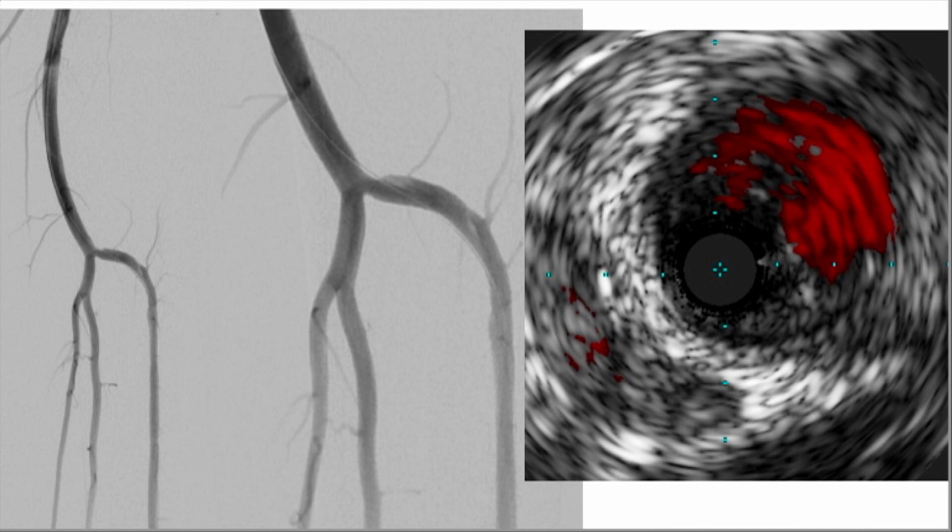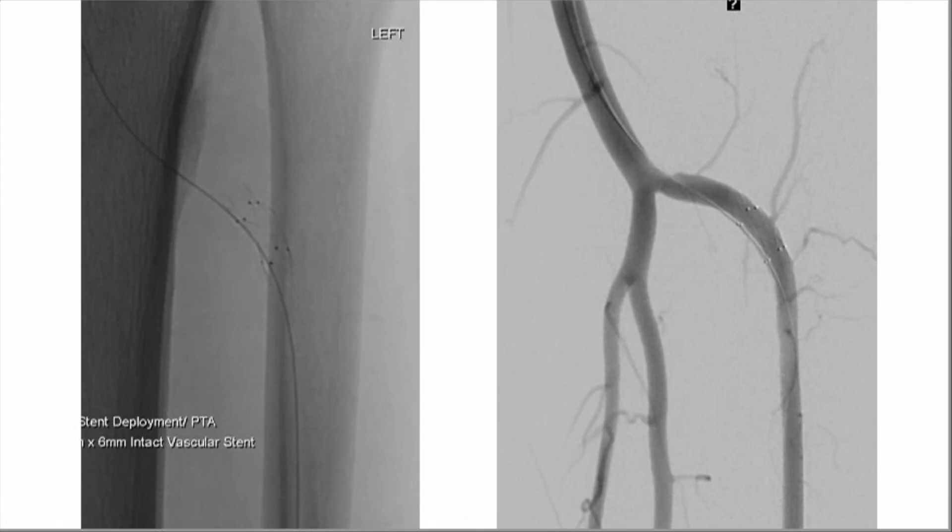Before having this device, this would have received a coronary bare metal or drug-eluting stent. However, with the right tool, two TAC devices were deployed in exactly the fashion I wanted — I can stack them closer or spread them out, and there are enough tacks in that one deployment set to cover the area needed. The result is a nicely tacked vessel without an unnecessary stent. This is a self-expanding device, so it conforms to the vessel size rather than requiring a balloon-expandable stent sized for coronary circulation.